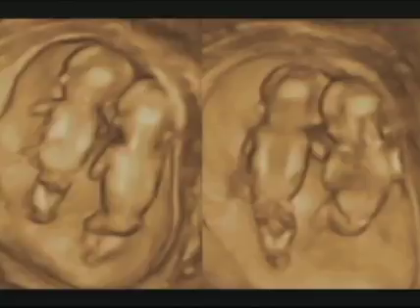These are two little guys that came in to have their nuchal translucency measured, and here we're imaging them from the back, and I just want to show that you can see all 4 ears. You can see both ears in both fetuses, showing you that in fact this is a great time to image the ears by doing surface rendering. And it's not something that we normally think of doing at 12 weeks, is to take a look at the ears.